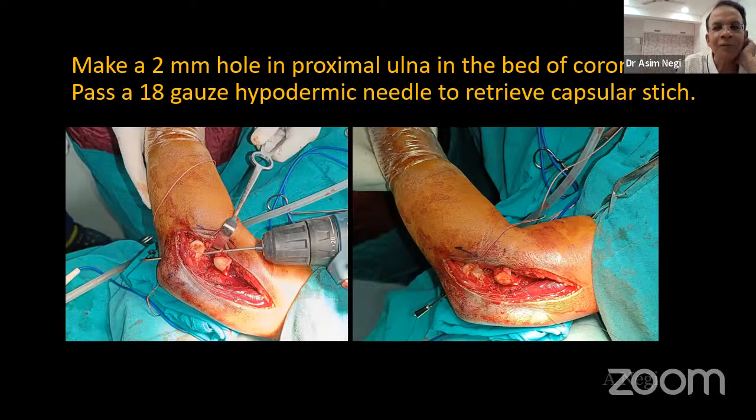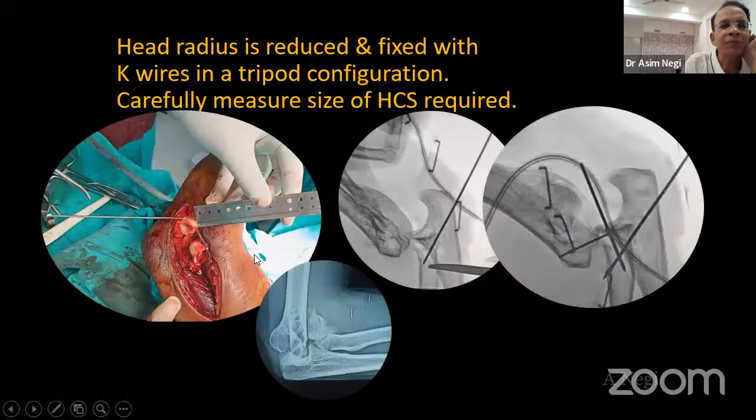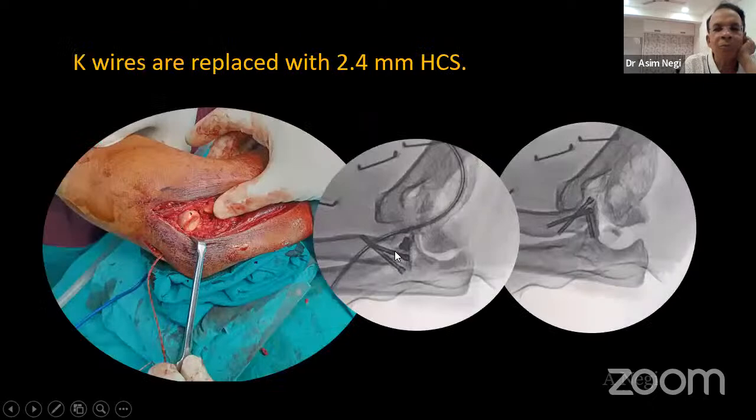These capsular stitches were pulled out with the help of a 2-0 Ethilon, making a loop there. Then we reduced the head radius and fixed it with K-wires in a tripod configuration, as you can see here. This is the tripod we constructed for the head radius: 1 transverse wire and 2 cross K-wires. Then these K-wires were replaced with 3 headless compression screws to stabilize the head radius.